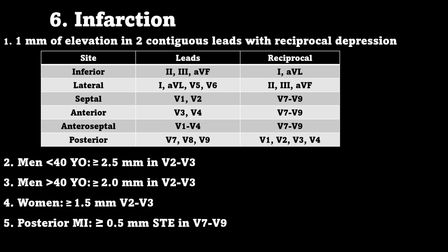I do want to say that this isn't super sensitive. I've had multiple patients with isolated posterior STEMIs who unfortunately did not have any elevation in my posterior leads, but I did have ST depression in V1 through V4.